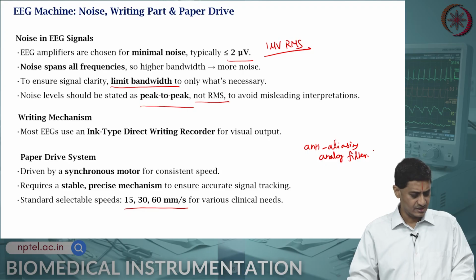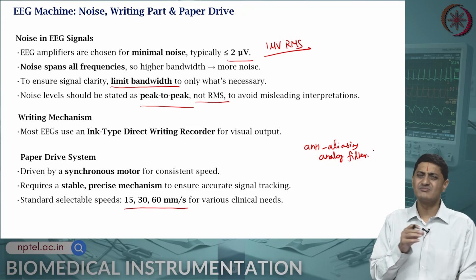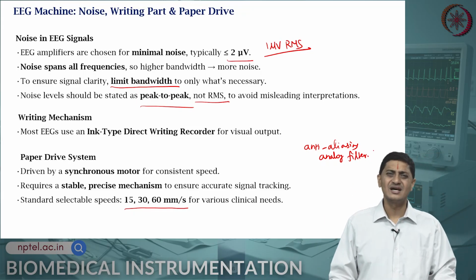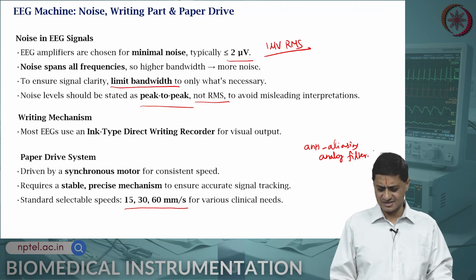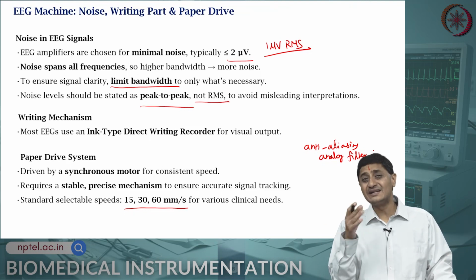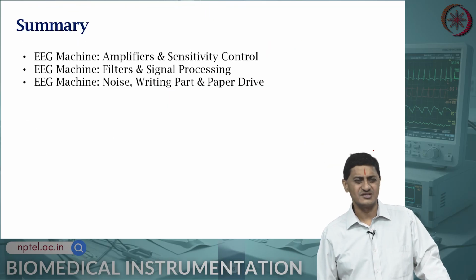The other assumption is that if I have properly shielded cables, I can essentially remove all forms of interference. This is not true. Magnetic interference cannot be avoided by shielded cables.